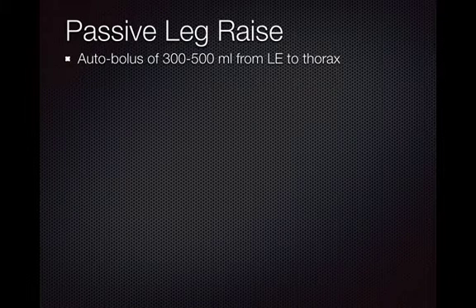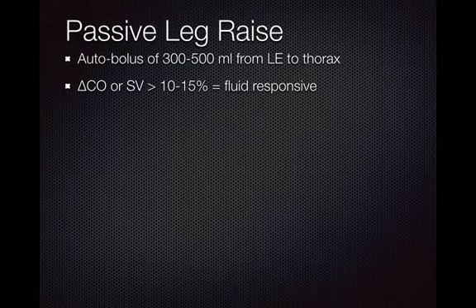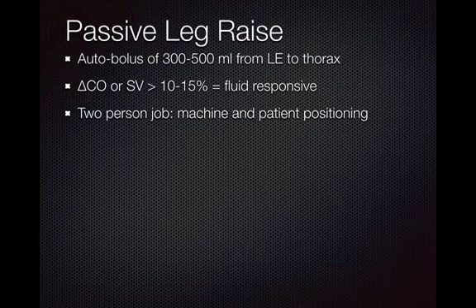And remember that a passive leg raise is an auto bolus of about 300 to 500 cc's from your lower extremities to your thorax, and it's completely reversible. If you see an increase in the cardiac output or stroke volume of anywhere from 10 to 15%, depending on who you read, they're fluid responsive. If it's less than that, then they're not fluid responsive.